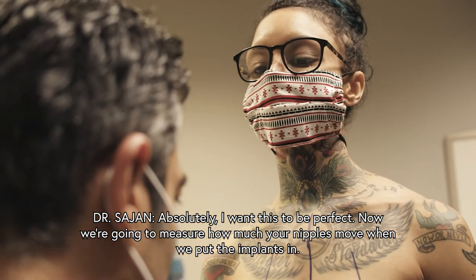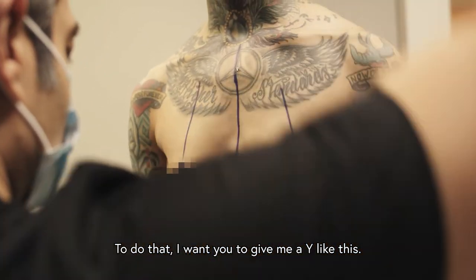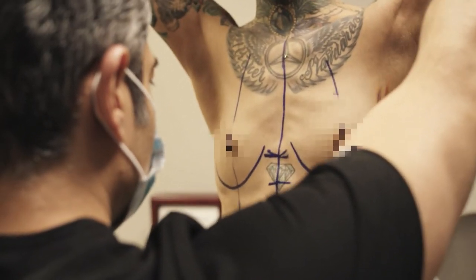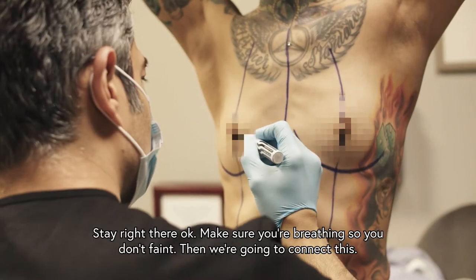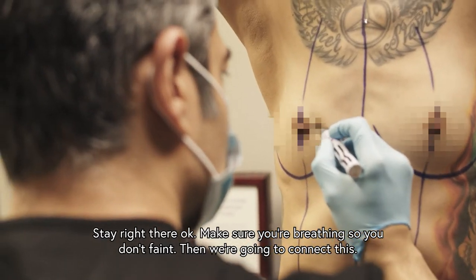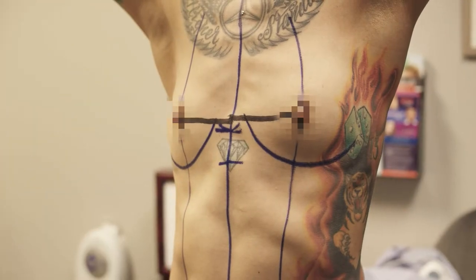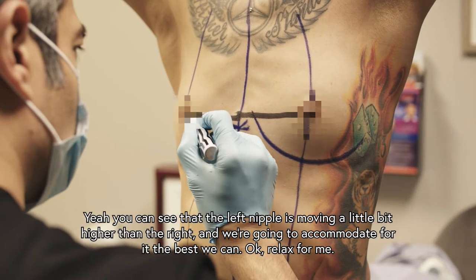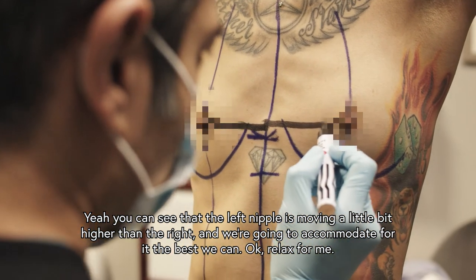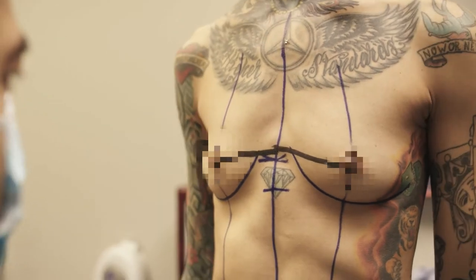Now we're going to measure how much your nipples move when we put the implants in. To do that, I'm going to give you a Y like this. Perfect. Stay right there. Make sure you're breathing so you don't faint. Now I'm going to connect this. You can see that the left nipple is moving a little bit higher than the right, and we're going to accommodate for it the best we can. Okay, relax for me.